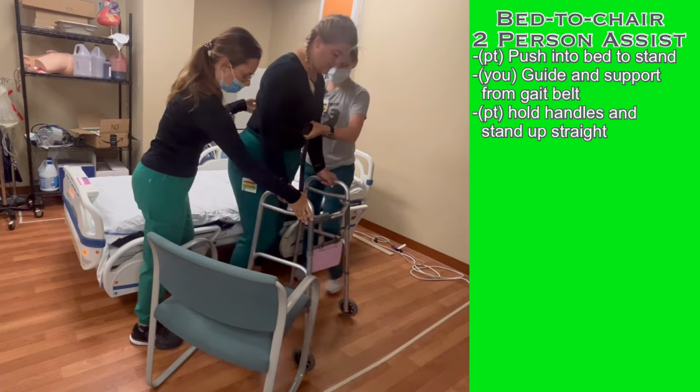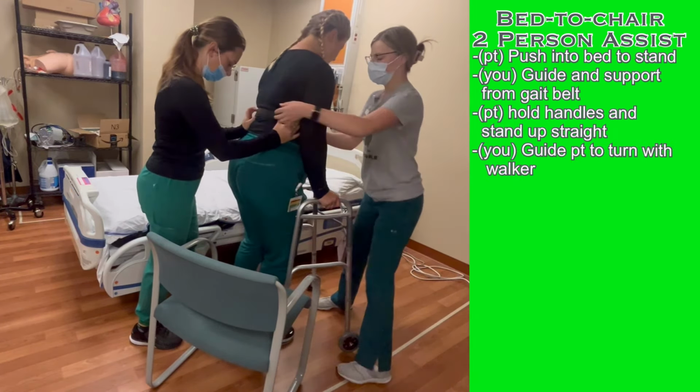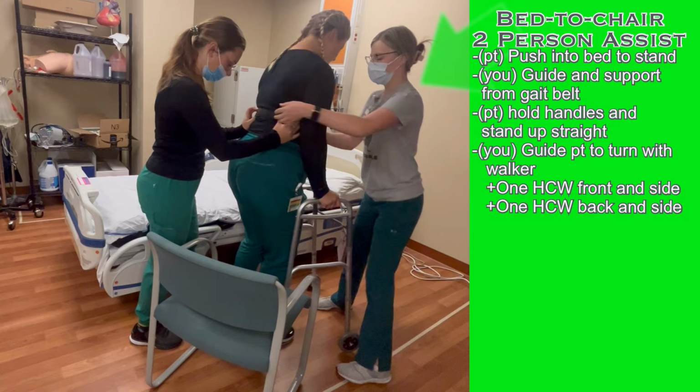With the patient in a standing position, use the gait belt to guide the patient as they turn with the walker. One healthcare worker should be to one side and in front of the patient, and the other should be to the other side and behind the patient, both supporting and guiding from the gait belt.